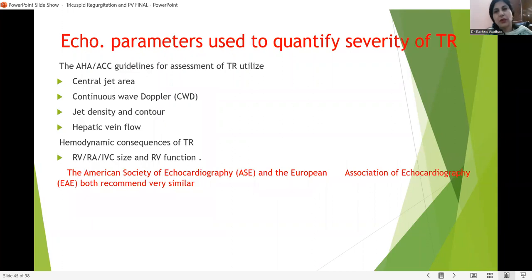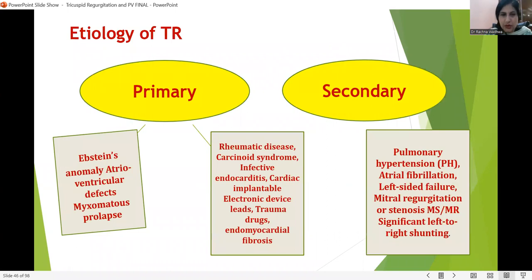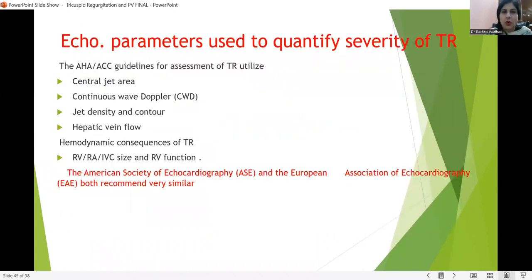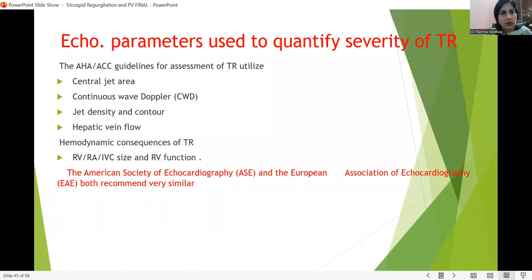After qualitative and semi-quantitative assessment, quantitative assessment is important. We calculate the central jet area, all measurements from continuous wave Doppler, the jet density and contour, hepatic vein flow, RA, RV, and IVC sizes, and RV function. These all have to be assessed by TEE — 2D, 3D, or 4D nowadays. With new 4D machines, next time we will have 4D images as well.